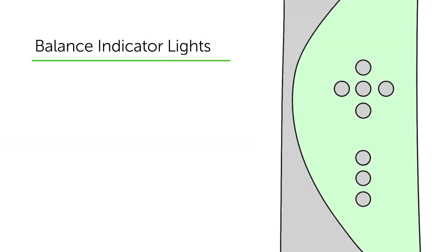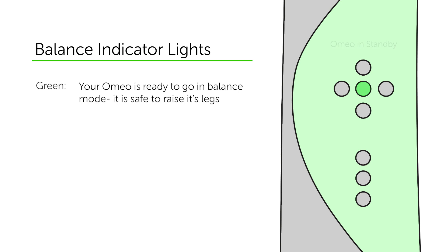The star pattern lights on your display panel are there to indicate your balance status. Green indicates that your Omeo is ready to go in balance mode and it is safe to raise its legs.